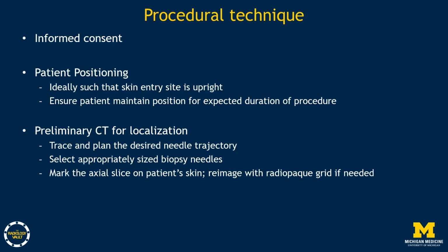After you have approved the patient and nodule for biopsy, the next step is to obtain informed consent to explain the procedure, potential complications, and to set expectations. As radiologists, you often do not have the benefit of seeing a patient in clinic in the preceding days or weeks, so the consent process is typically performed immediately prior to the procedure. Therefore, it is imperative not to rush this process and to ensure the patient understands what the procedure entails and accepts the associated risk. Patient cooperation is paramount for successful lung biopsy.